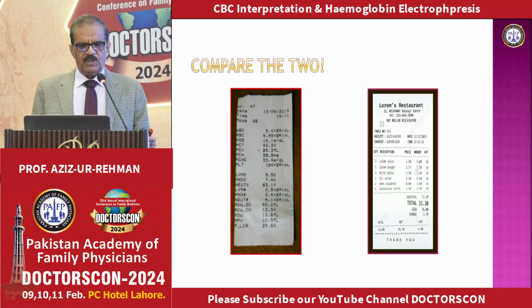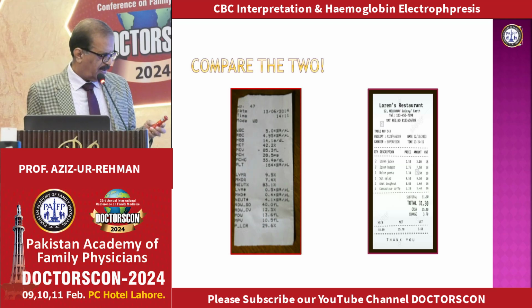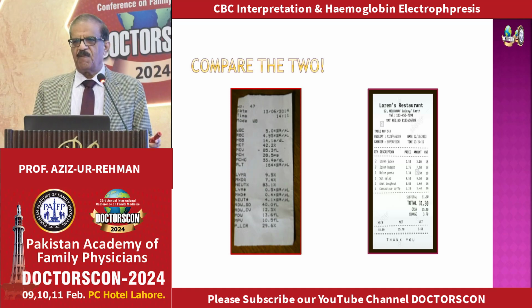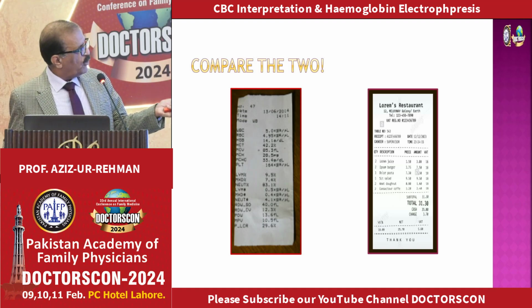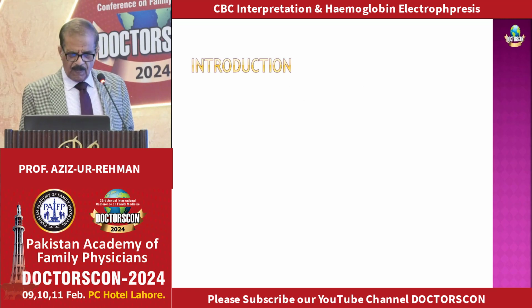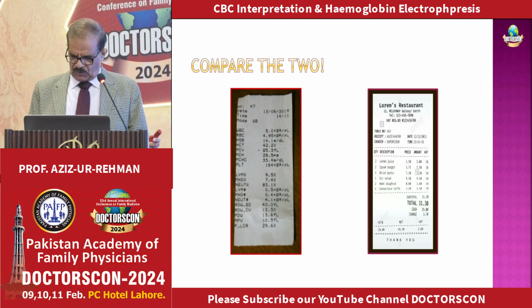Now compare these two. On one hand, you have very unflattering, unimpressive, computer-generated CBC report. Most laboratories will reprint on the proper paper, but the original report comes from the machine like this one, and in many public sector hospital, this one is given to the patient. It's just like a very unimpressive invoice you get from the grocery store.